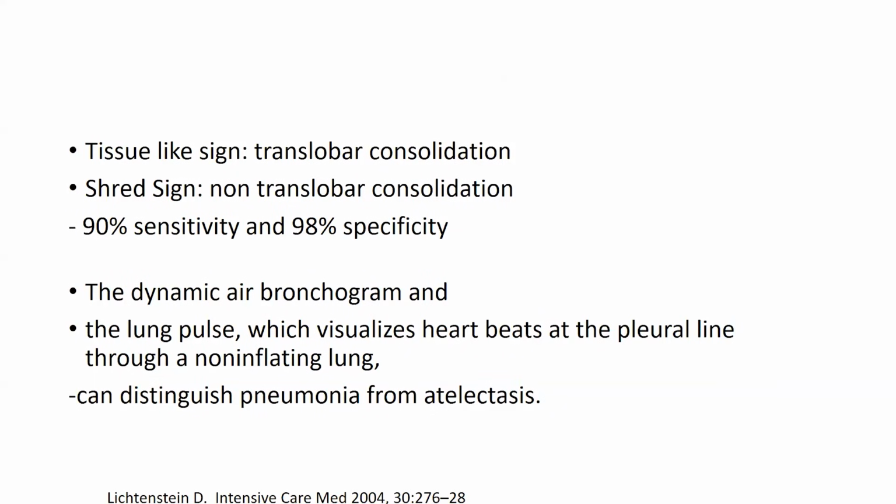As I told you, in consolidation there is no air going inside the lung. That can happen in cases of atelectasis also. So to distinguish between pneumonia and atelectasis, if you see signs like a dynamic air bronchogram or lung pulse, then it definitely distinguishes between the two.